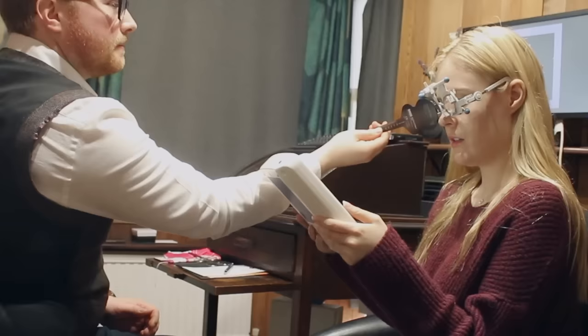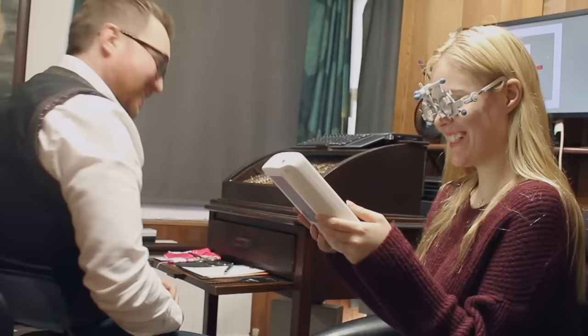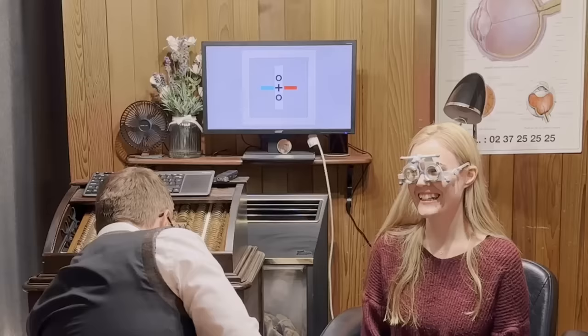Yeah. Do you want to just read the first few words for me? So that year I got a paper route. Before school I would ride my bicycle around my neighbourhood. Brilliant. Don't worry, it doesn't get any more exciting, I'm afraid. Brilliant. Okay, so we're getting a very good level of vision. Excellent. Let's pop those off.